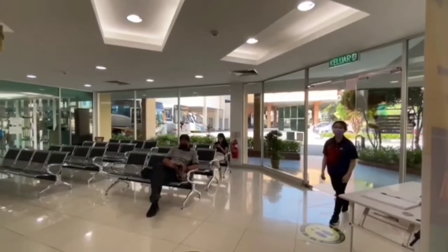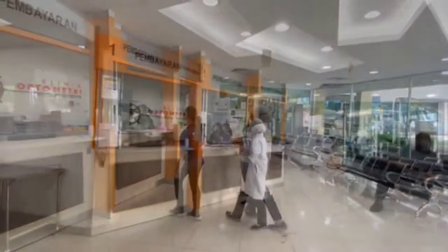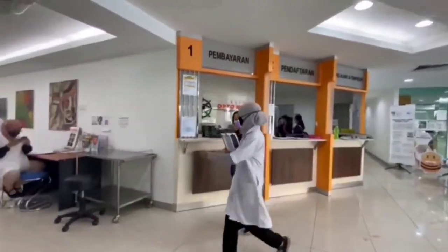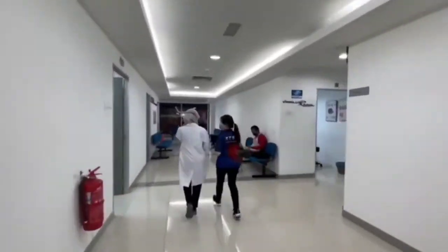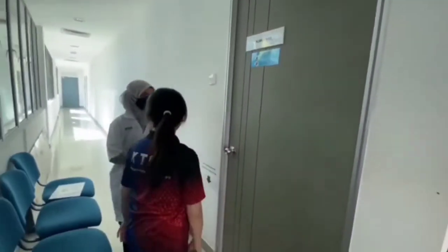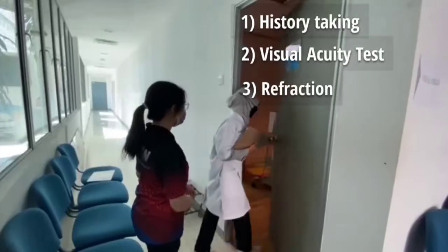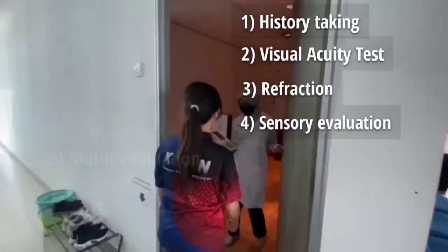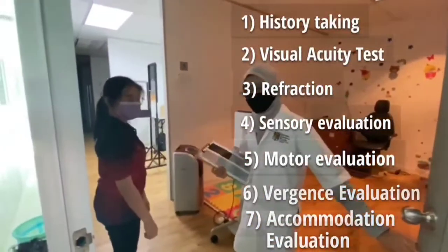The patient will enter the optometric clinic and register at the registration counter. The examiner will then lead the patient to the BV clinic. At the same time, the examiner is observing the patient. The procedures that we usually do in the BV clinic are history taking, visual acuity test, refraction, sensory evaluation, motor evaluation, vergence evaluation, and accommodation evaluation.